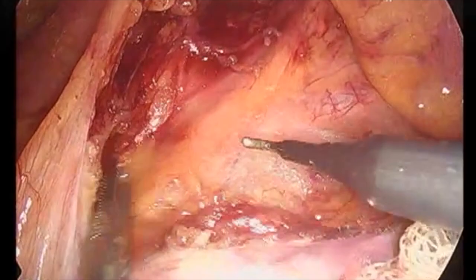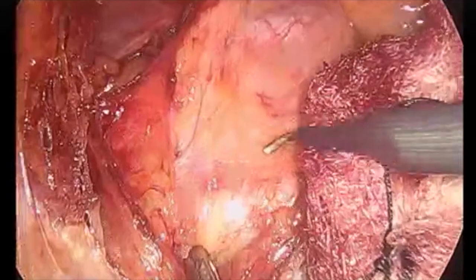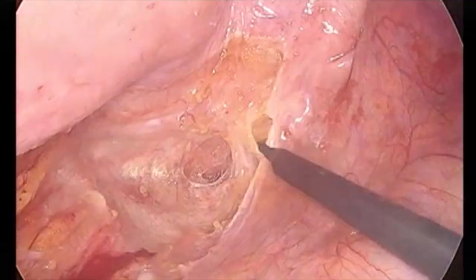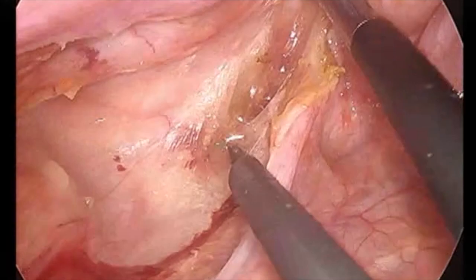After the medial dissection is done, a lateral plane is created to identify the ureter, and the ureteral gonadal complex is dropped down. That's the bifurcation of the iliacs — you can see the hypogastric nerves there. The proper plane is maintained between the rectum and the presacral fascia.